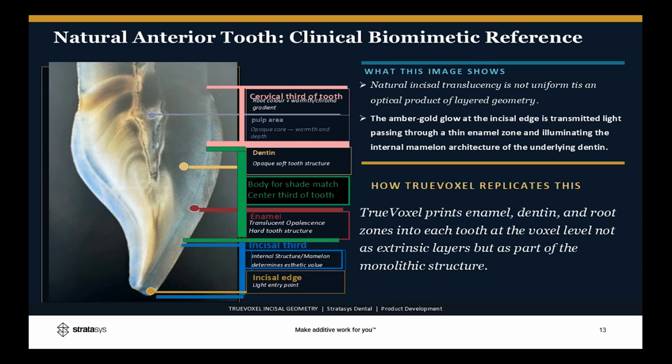In looking at this, as we mentioned, the goal is to really mimic the principles of biomimetic dentistry, to copy nature in prosthetics. We've seen a lot of carded denture teeth that have different types of layers. Some denture teeth are sold at 2 layers, 3 layers, 4-layer denture teeth. And of course, the more layers you have, the more aesthetic and more expensive it's going to be. And so this is what we're integrating into these two designs and solutions.